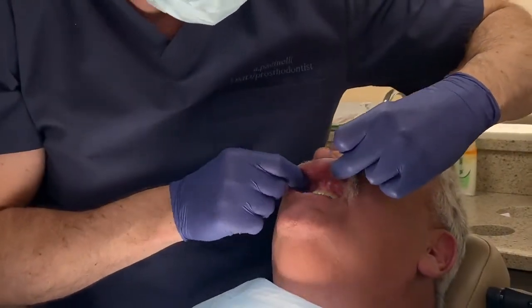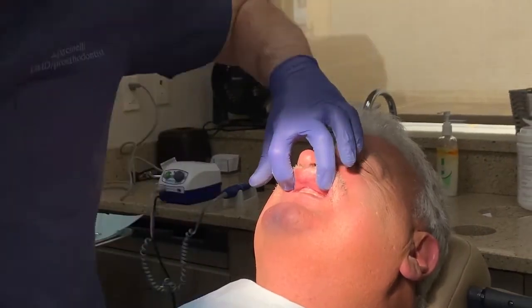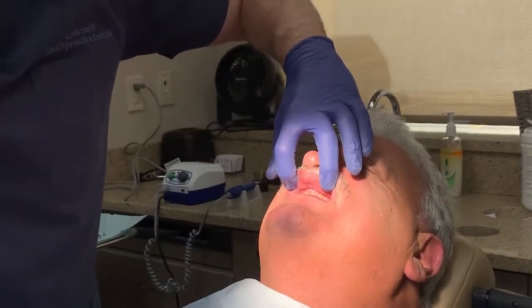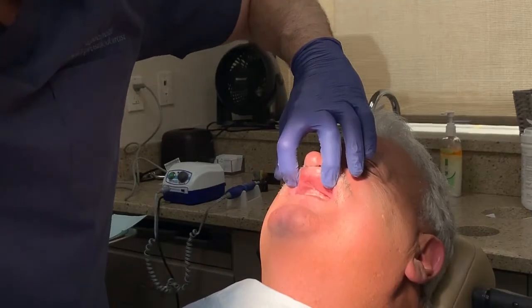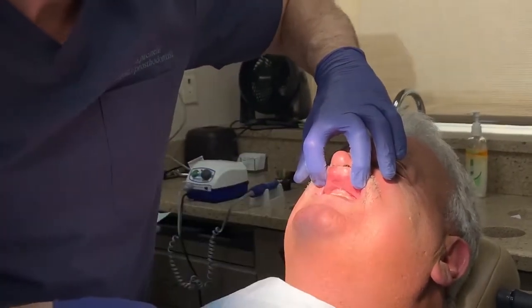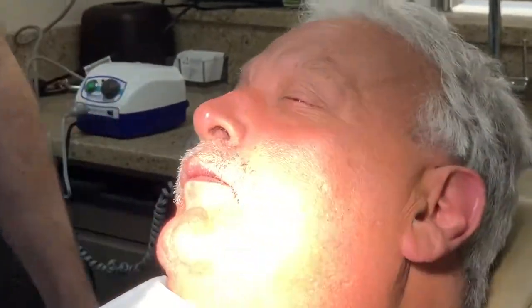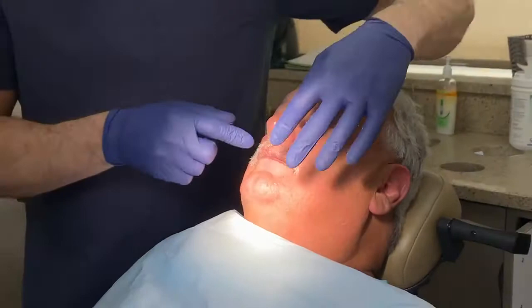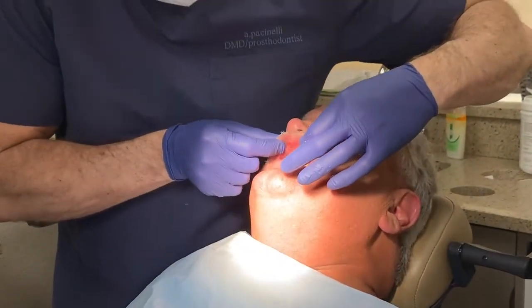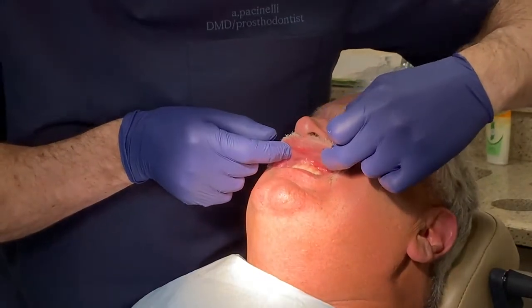Close down. I think we're doing a little blanching, but not nearly as much, right? No, just a little bit. Right. So I'm going to take it out one more time, and I'm going to make a little bit of an adjustment. How does that feel now, Joe? Close down for me. There you go. All right, we got rid of the blanching.